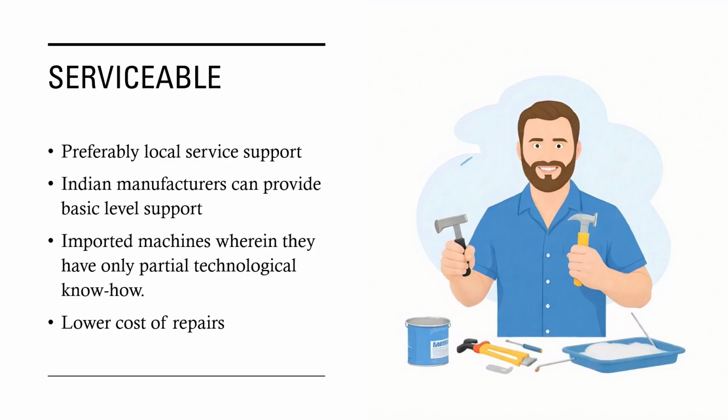And coming to the future issues, when you have purchased the machine, it should be serviceable. Preferably, local service support is very, very important so that you have very fast repairs. Usually, Indian manufacturers are able to do so. Not only that, Indian manufacturers like Appasamy can provide you basic level support because they are the manufacturers, so they know the machine inside out.